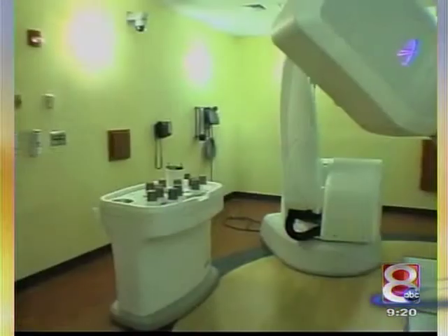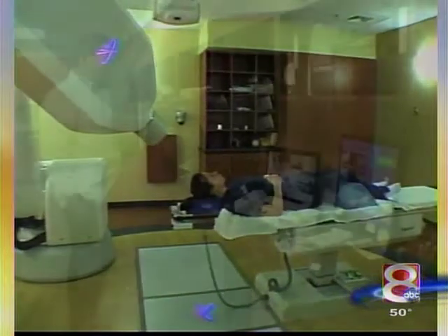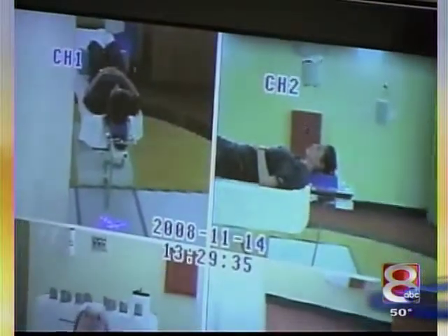Now, what does this mean for patients? I mean, you talk about cutting down time for them. Dr. Kempe, you were talking about the patients earlier, and we've had patients in before who are just amazed that they can drive themselves away from treatment. Correct. It doesn't require sedation. It's usually a very short treatment and a relatively small number of treatments compared to conventional radiation therapy, so that patients can complete the course quickly and really with minimal disruption of their lives.